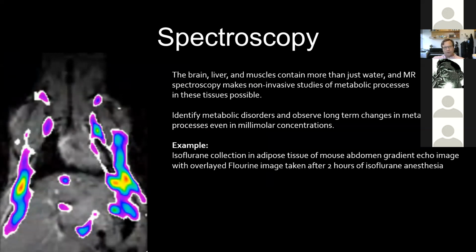So I think most folks probably know that the full original name of MRI was actually NMRI, for nuclear magnetic resonance imaging. And they got rid of the nuclear because when it was developed, the idea of nuclear anything was a little bit scary to the general public. But the nuclear is kind of important because it means NMR, right? So this is an imaging version of NMR.